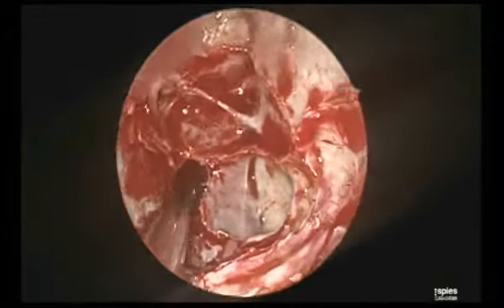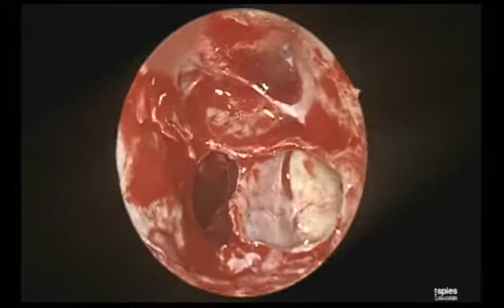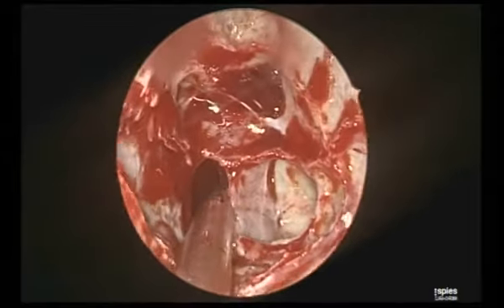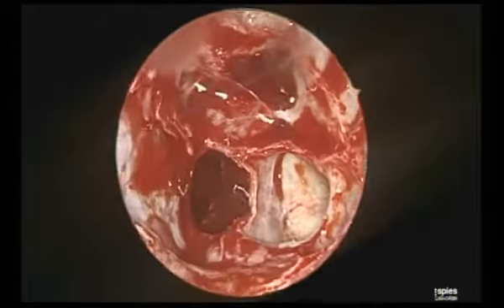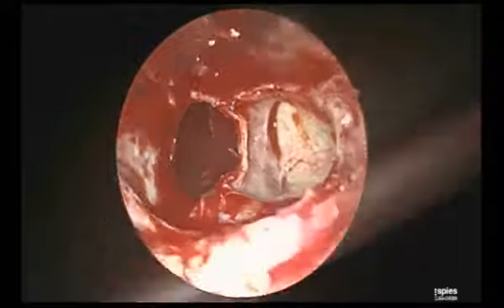Now, Ashish, see the importance of this. Sphenoid sinus, where I am limiting myself to the level of the sphenoid sinus. Can you see? Now I will enlarge the anterior wall to its lateral limit, and there is no fear of the carotid, because the carotid is way posterior.